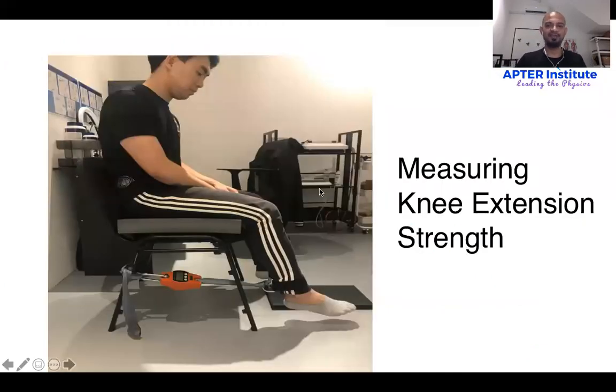What I generally use is a crane scale. As you can see here, this is a setup for measuring knee extension strength. I've placed a balance pad or cushion so that the knee is dangling. We position the crane scale by attaching one end to the chair and one end with an ankle strap to the lower end of the knee. We then ask the patient to perform a knee extension to maximum voluntary contraction, starting at around 90 degrees and extending to around 60 degrees.